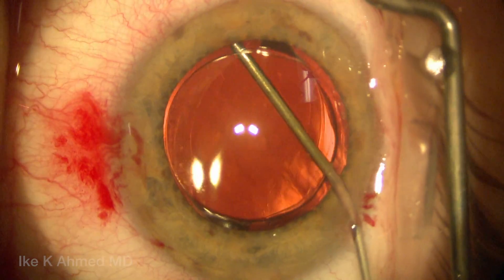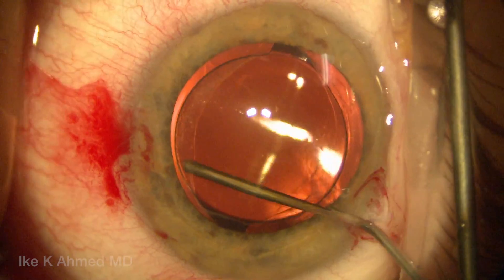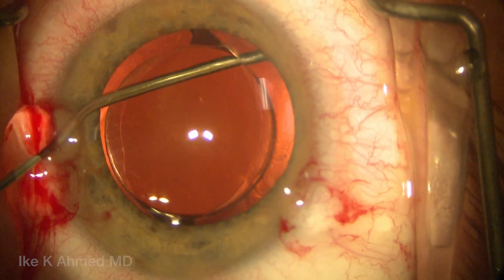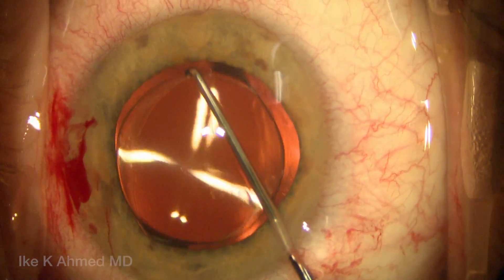We're going to first do some visco dissection, injecting posterior to the optic into the capsular equator and fornices to free up the entire capsular bag. We do this for 360 degrees around, going superior and inferior first. What's most important is to inject particularly in the area around the haptics.